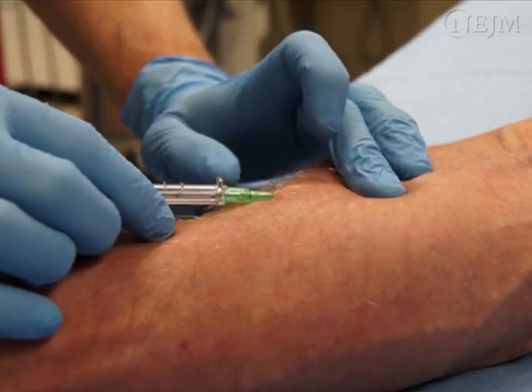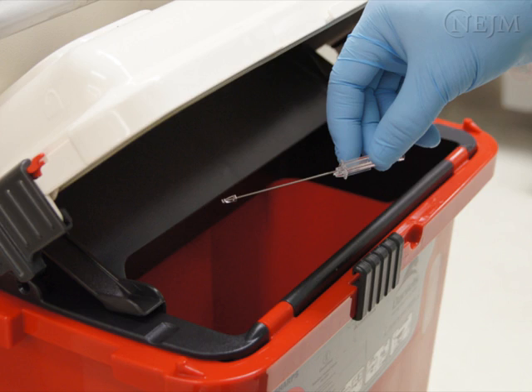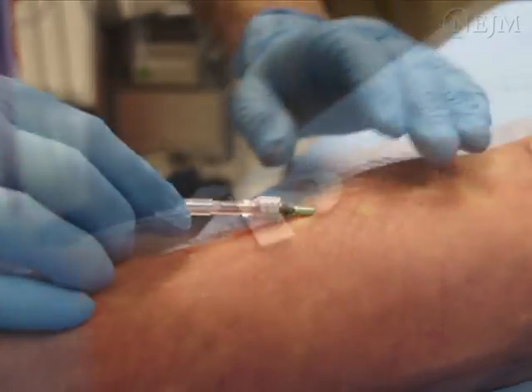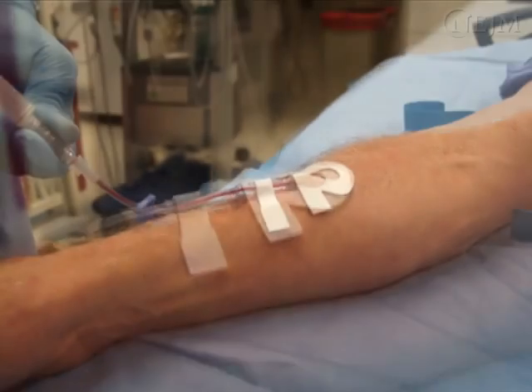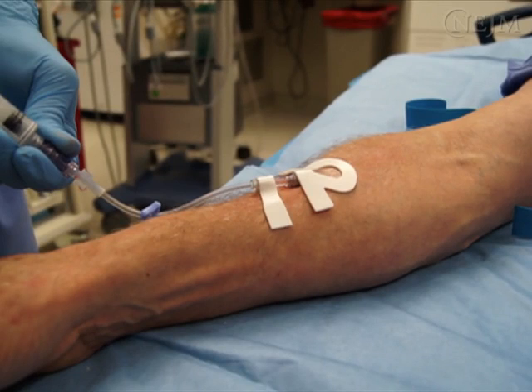Apply firm pressure to the vessel proximal to the tip of the catheter. Remove the needle and place it into a sharps container. Remove the tourniquet. Place the luer lock adapter on the end of the catheter. Anchor the catheter, adapter, and connection tubing to the skin using adhesive dressing. Flush the catheter with sterile saline. The flush should flow smoothly into the catheter. If there is resistance, the catheter may be kinked, occluded, or outside the vein. Look for signs of extravasation, such as pain, swelling, or blanching.